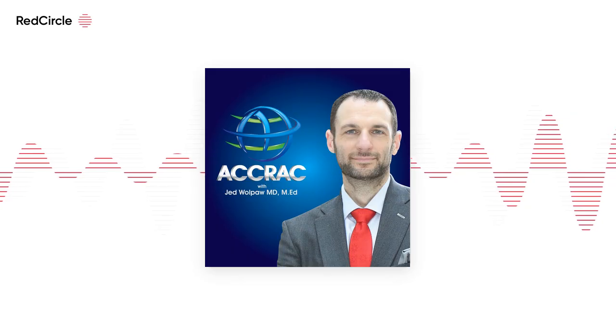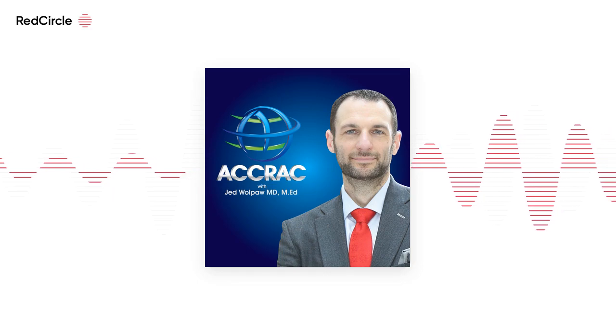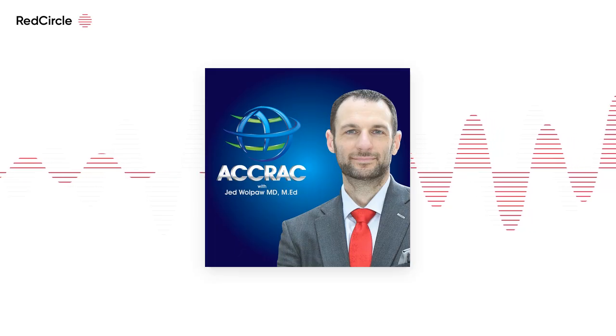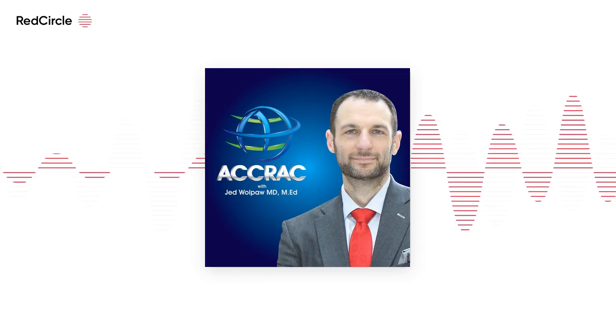So most people were using 40 for 40. The Lovs trial used 40 for 40 for recruitment maneuvers. The HFO oscillator study also used 40 for 40. So, we have this idea of maintaining a pressure of 40 centimeters of water sustained over time to pop open areas of the lung. Then you start at a higher level of PEEP.